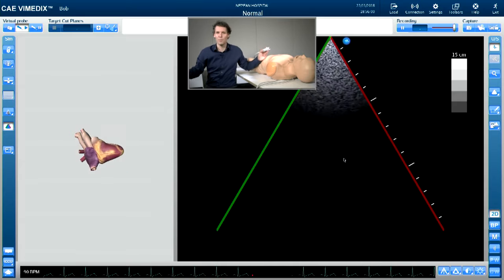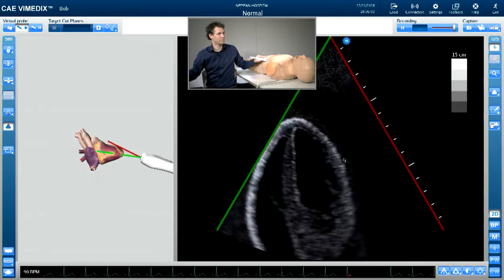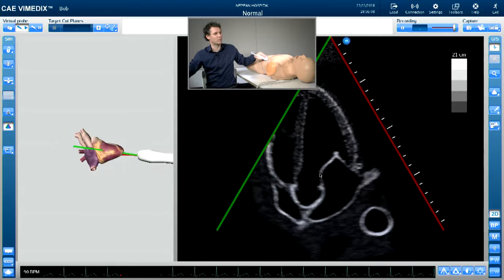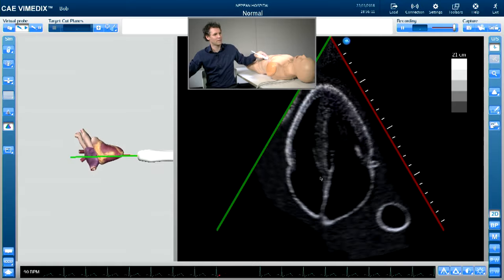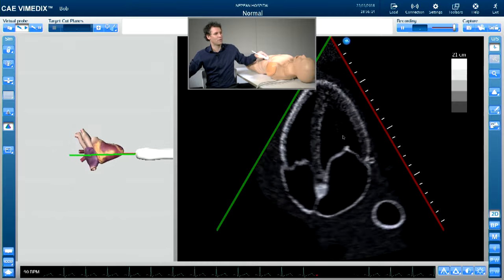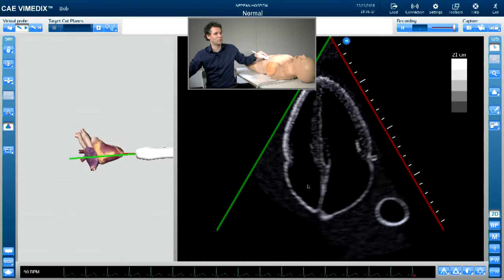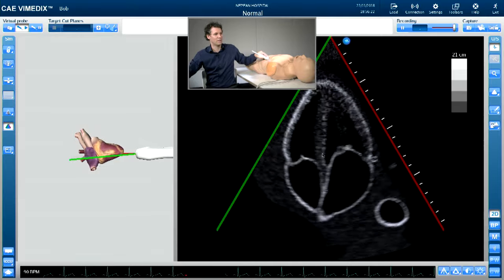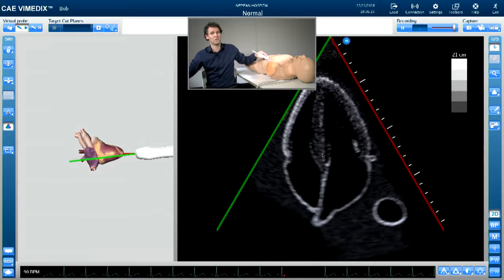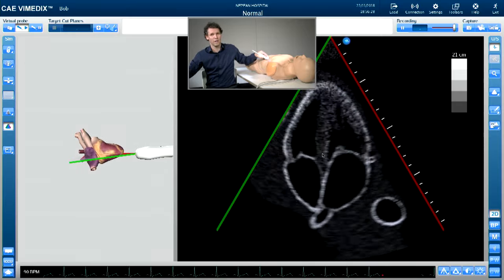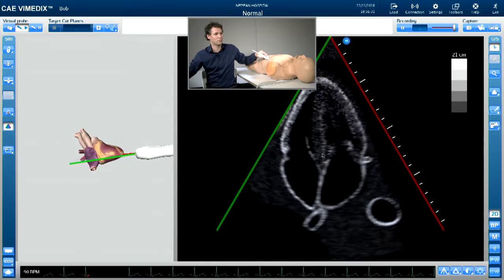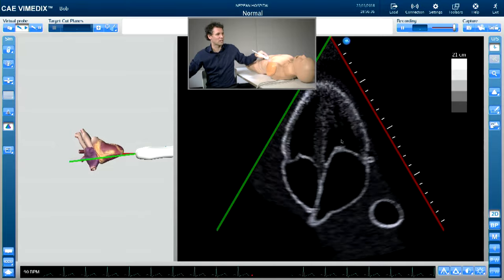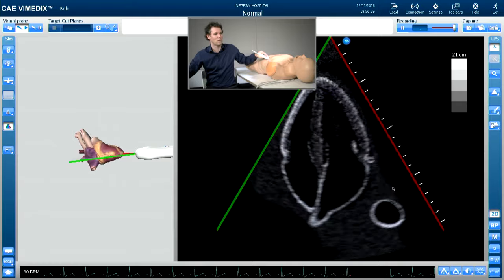Now we're going to move on to the apical views. With the marker pointing down towards the bed, we try and find our apical view with the left ventricle, the right ventricle, the right atrium, and the left atrium. Here we have the mitral valve and here's the tricuspid valve. We're going to try and assess valvular function, systolic function, and diastolic function of both the left and the right ventricle. We can start off with a subjective assessment of left ventricle size and function, the same for the atria.